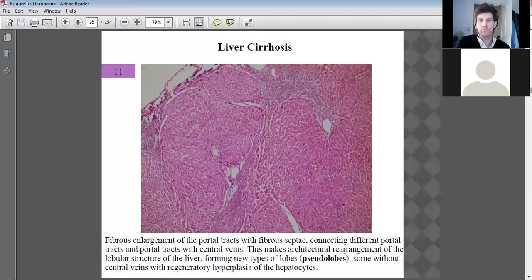But with cirrhosis, you get lots of what we call first fibrous tissue, and then later you can get lots of lipid deposition in the tissue. So if we look here, you can see some fibers forming here. There's a lot of fibers there. Now, normally you wouldn't find so many of these fibers. This is too much, lots of fibers. And if we go to the top, there's also a lot of fibers. It's a bit too much, and some of the fibers are encroaching on the central vein there.